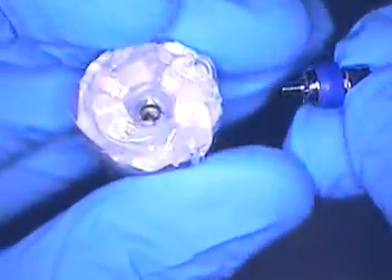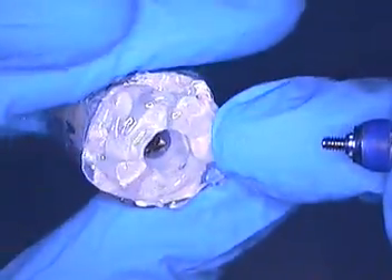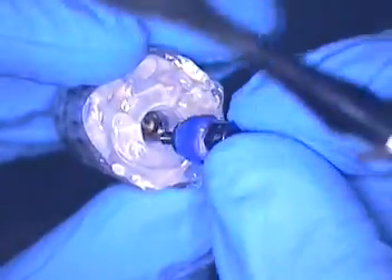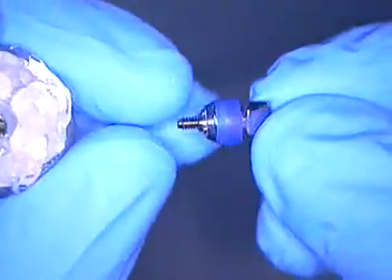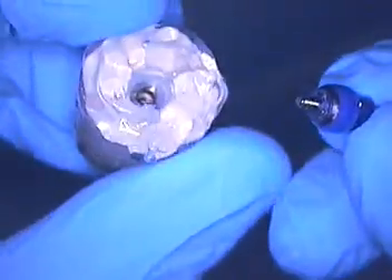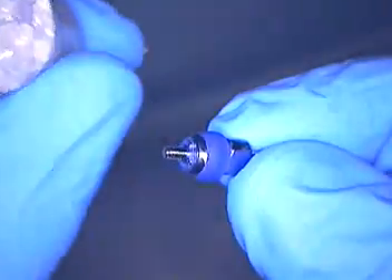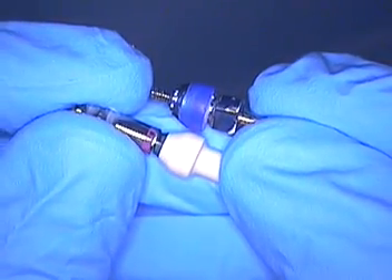I'm just going to lift this out — it comes all out in one piece. And there it is. So now we have the replica of this. That's what I'm going to use to transfer again — I'll put another impression coping in there and transfer that data, because this is what's going to be picked up in the impression. Why not give the lab another one so they can scan it and then mill the abutment? There are the contours — here's Straumann, here's Nobel. Very closely matched.